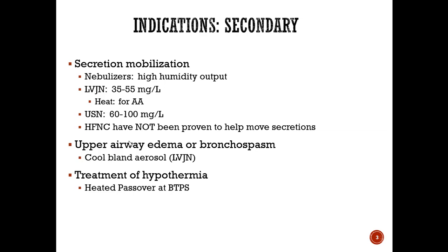The high flow nasal cannula, I just want to throw this out there. If you are going to put somebody on a blender for secretion mobilization, and that's why you're putting them on there, because you're treating this secondary indication, the high flow nasal cannula is not great for secretion mobilization. Just when you think about the fact that it's throwing flow through the nose only, and it just doesn't have as much surface area as a mask.